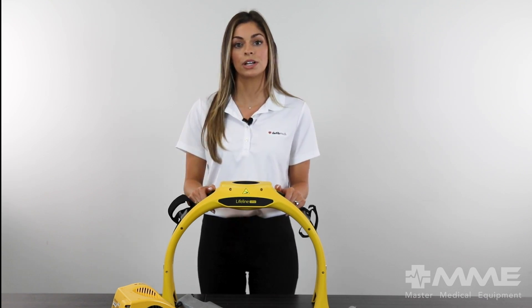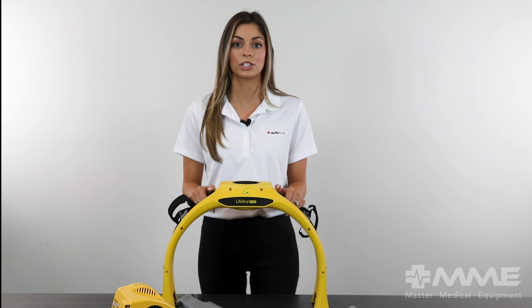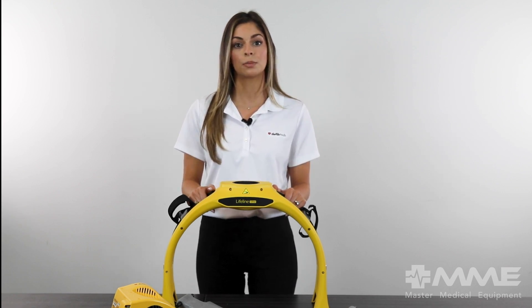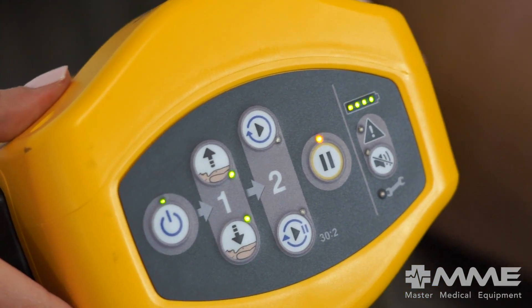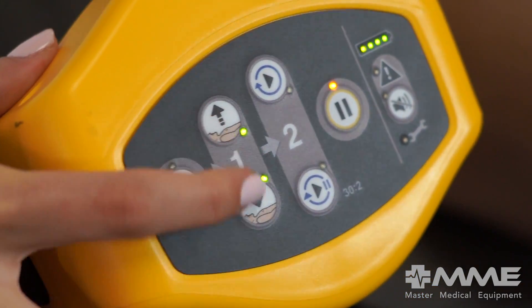The arm has a streamlined user interface that makes mechanical chest compressions a breeze. Starting chest compressions is simple with two easy steps. First, adjust the compression height to the patient's chest using the up-down buttons.